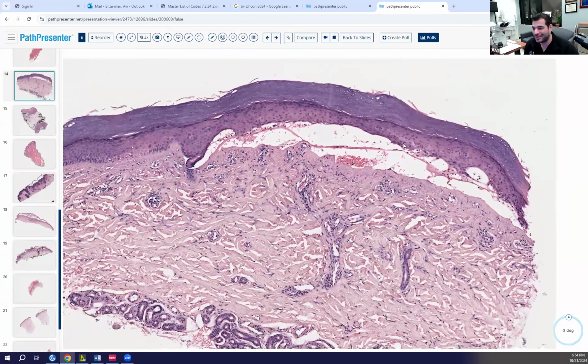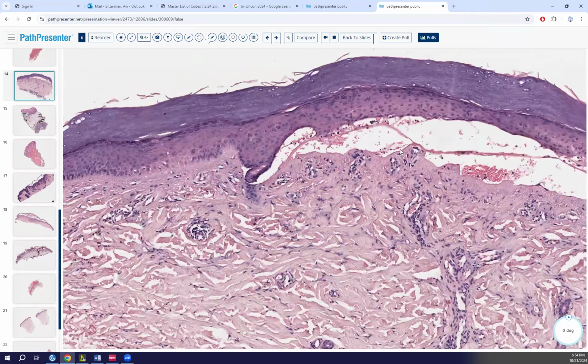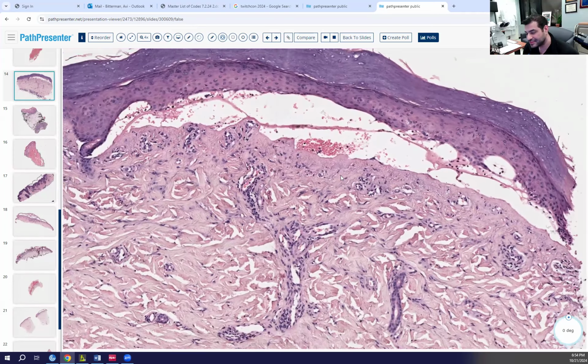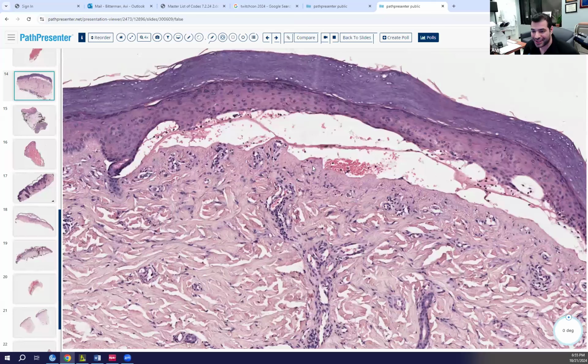This is not a caterpillar body, by the way. So we get out of the porphyria area. This is a subepidermal split on volar skin. Very pauci-inflammatory... there's some infiltrate. It's not non-inflammatory, it's pauci-inflammatory. So what's our differential for a pauci-inflammatory subepidermal bulla?